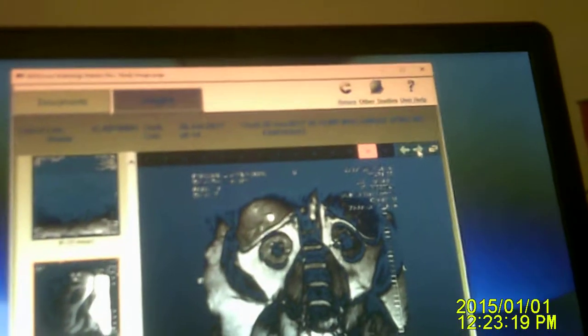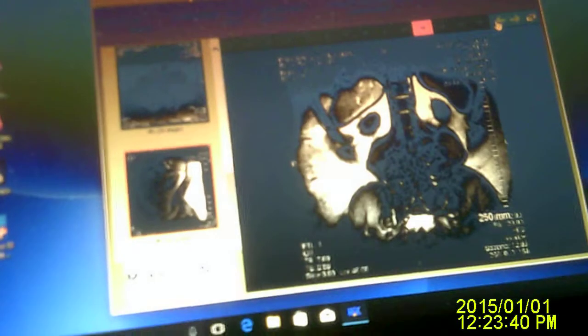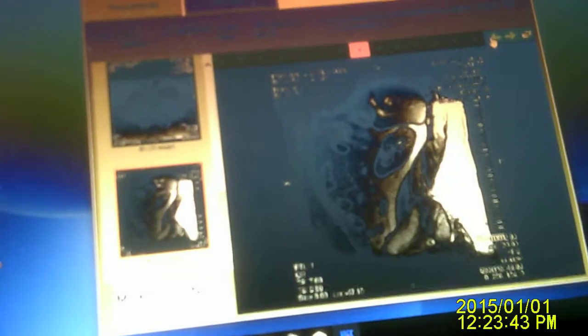Those are kidneys. And see, this starts to show something, but you see my kidneys, my lungs, and my back muscles, but it don't show enough. Alright. See? What is all that? The muscles. This here is the bone. This is the side view. And this is going down, but not far enough.